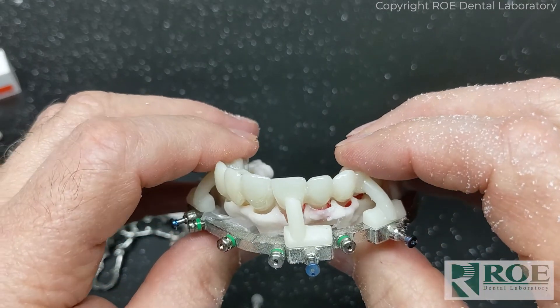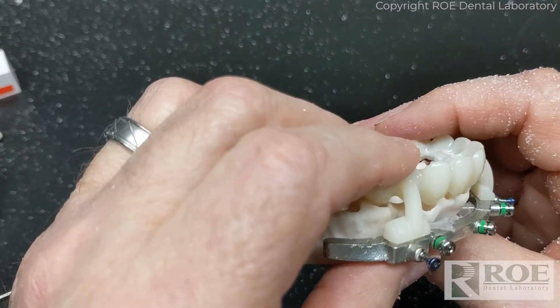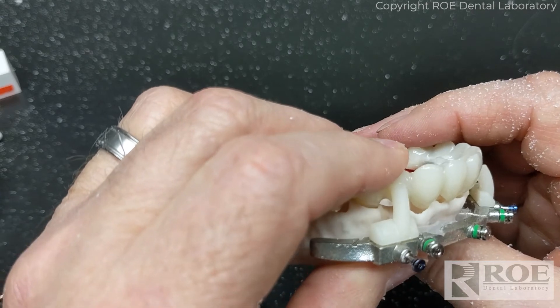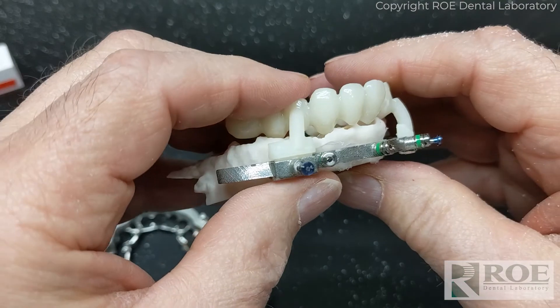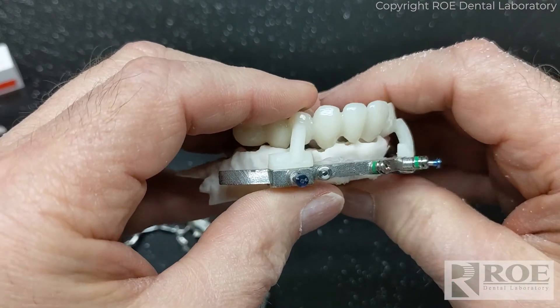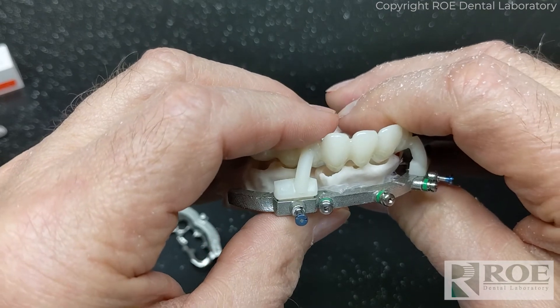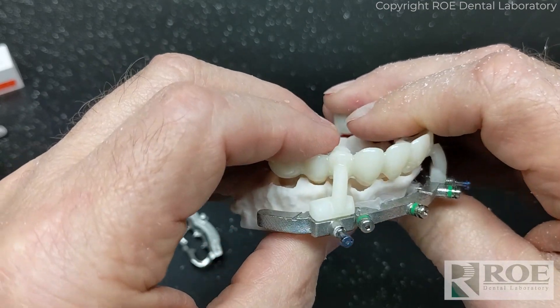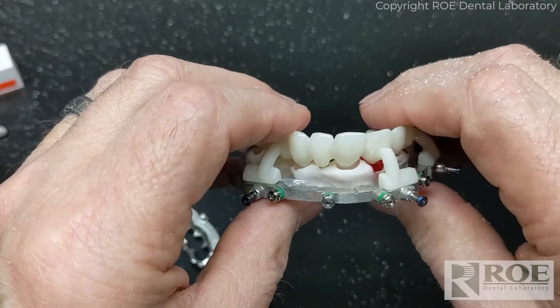A little bit more on the patient's left — you can see it will go down but has a little bounce, so we're very close. This strut does not fit down exactly without a bounce, so we're hitting somewhere. I just have to find it and relieve it so that we're free.